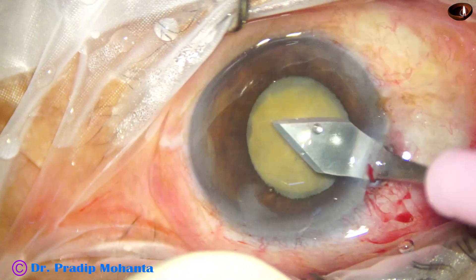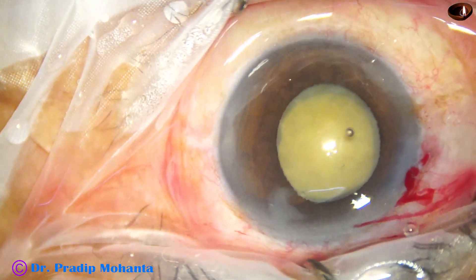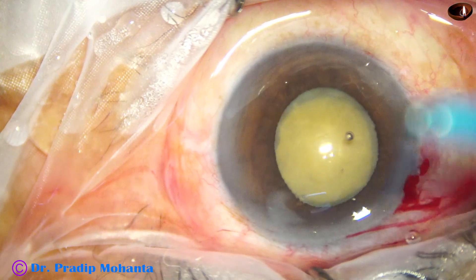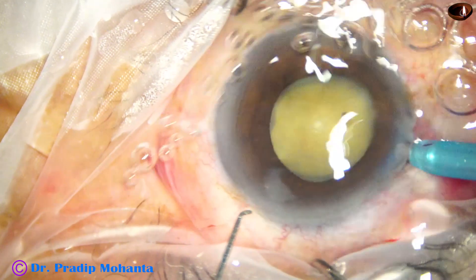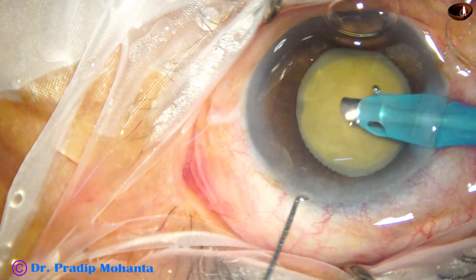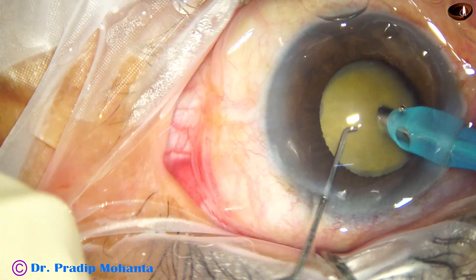As I have told, the main wound is enlarged to 3 mm. And then the phaco needle is introduced. The machine is Faros from Alcon. This is a 2.8 mm EZ-Tip from Alcon.